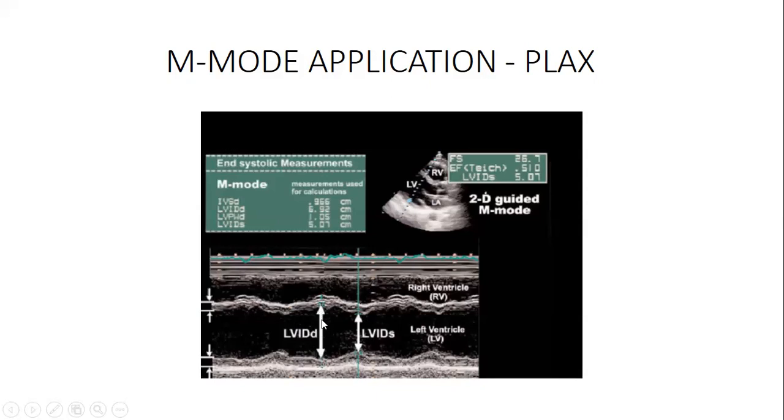Because the heart has relaxed. Then we also measure the septum, the IVS, from here to there, and the posterior wall from that point to that point.